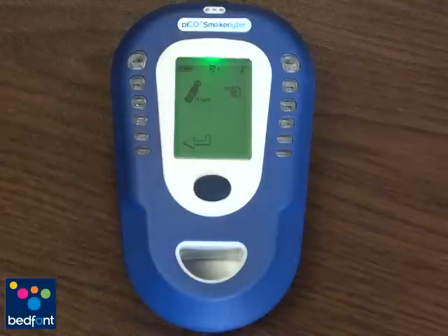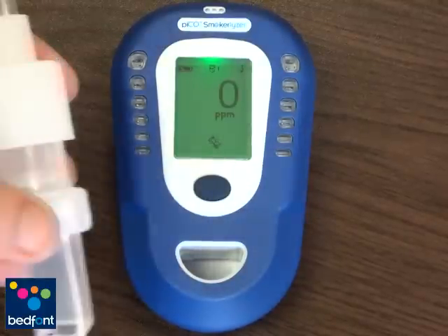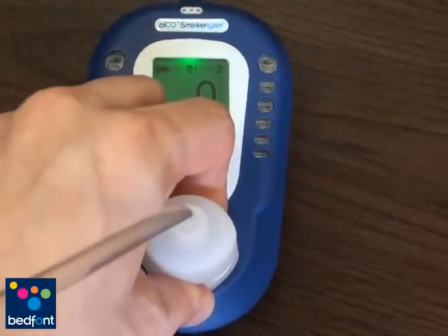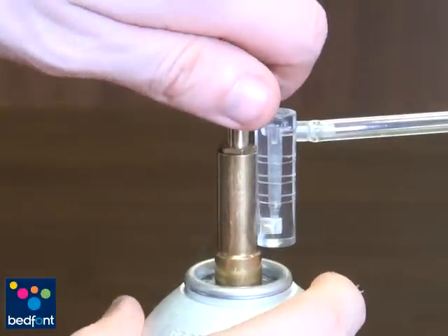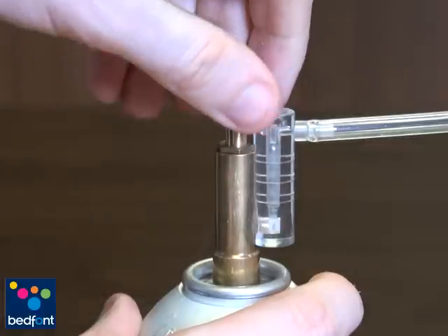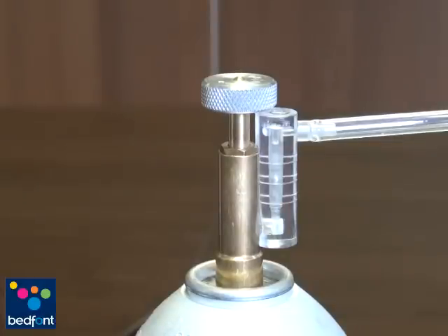Double click the cylinder icon on the PicoPlus by pressing the blue button twice and connect the D-piece to the PicoPlus. Immediately open the fine control valve and allow the gas to flow at 1 litre per minute. This is maintained by observing the ball in the flow indicator and adjusting accordingly.